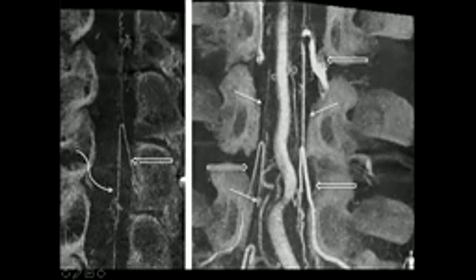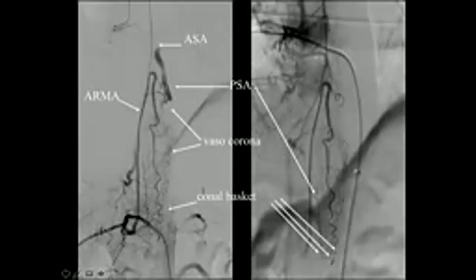This is the anterior radiculomedullary artery reaching the anterior spinal artery. These two are the posterior lateral spinal arteries. All these radiculomedullary branches, right or left side. And of course, this is not dynamic, and you need to compare those images with the regular angiographic images like this. And this is again the anterior spinal artery. This is the conal basket. And this is the vasocorona. You can clearly see that the posterior spinal arteries have anastomosis with the anterior spinal system. If you see those connections, you can have better treatment options, especially for glomus type or intramedullary type AVM, and also the perimedullary AVF.